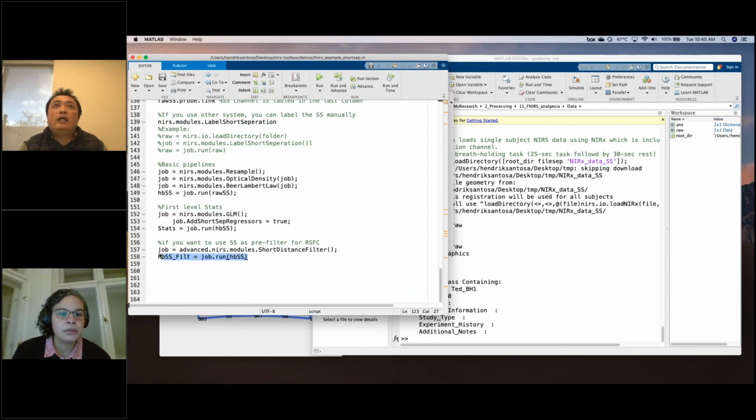For resting state data you cannot do the GLM, so you can use this as a pre-filter. Exactly. Ted put that one in advanced.NIRS. Usually we use NIRS.modules, but Ted put that one in the advanced folder. And this is also the one you used for the paper, right, to do the filtering? Okay.